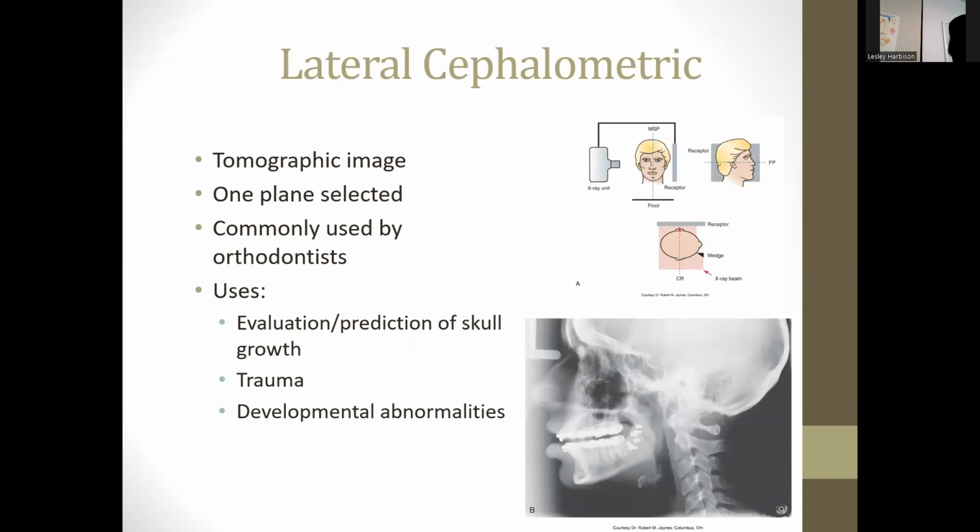That's all there is. So you can see most of it's nice to know information. I would expect you to know things that you could use it for: wisdom teeth, root canals, even though we didn't highlight it, but you did hear a classmate talk about root canals. But wisdom teeth, implants, those are big reasons why you should know that they're available. The field of view and that it's sort of more of a specialty, although you may see it more and more. Those are some of the take-home points that I would expect you to know about the 3D imaging.